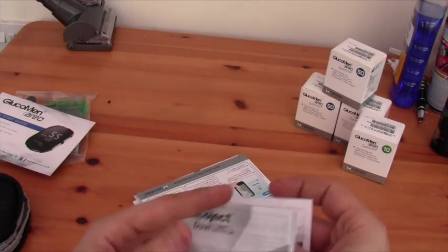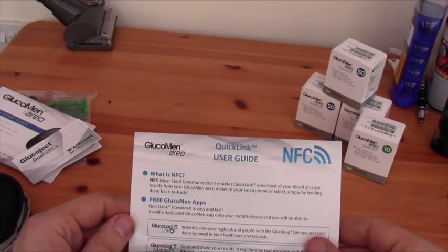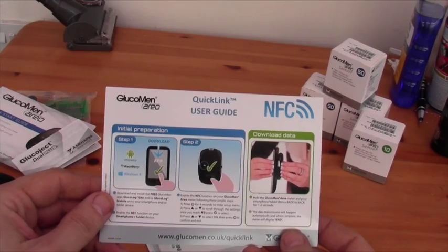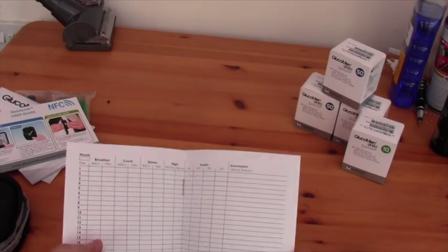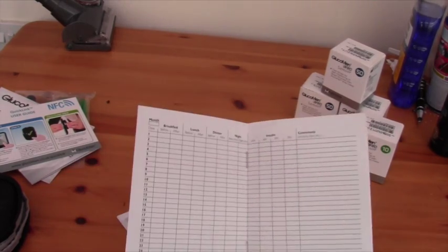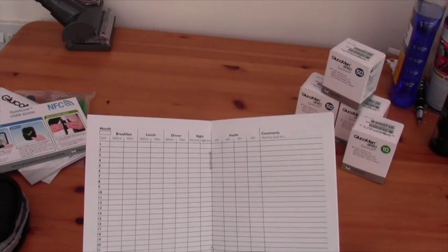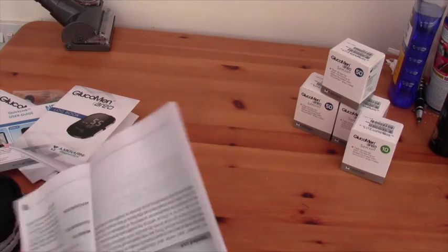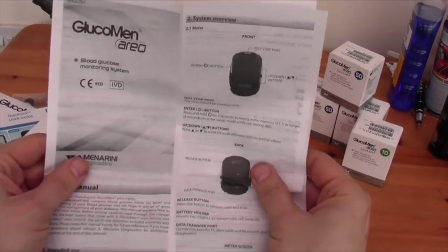That's just the instructions for the lancet device. There's a quick guide on the use of the NFC function. There's a logbook — but to be honest, one of the reasons you probably want this meter is because of the compatibility with a smartphone, so who needs one of those? And there are some slightly more in-depth instructions on setting up your meter.